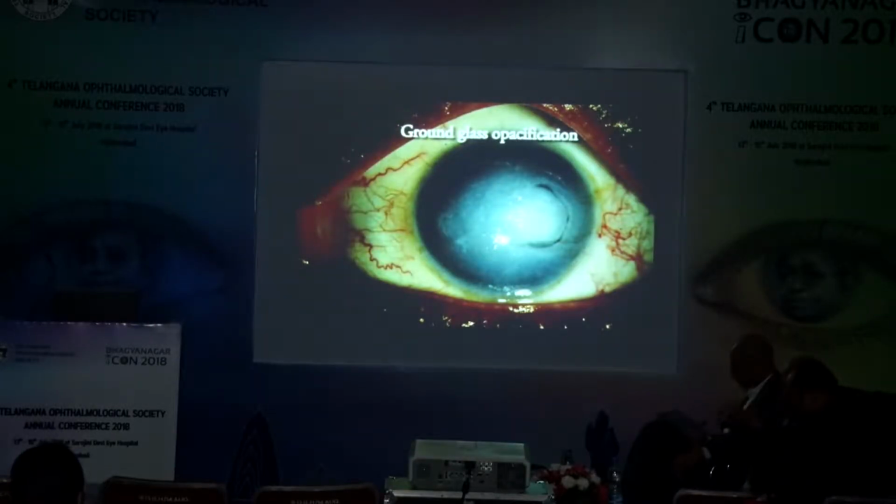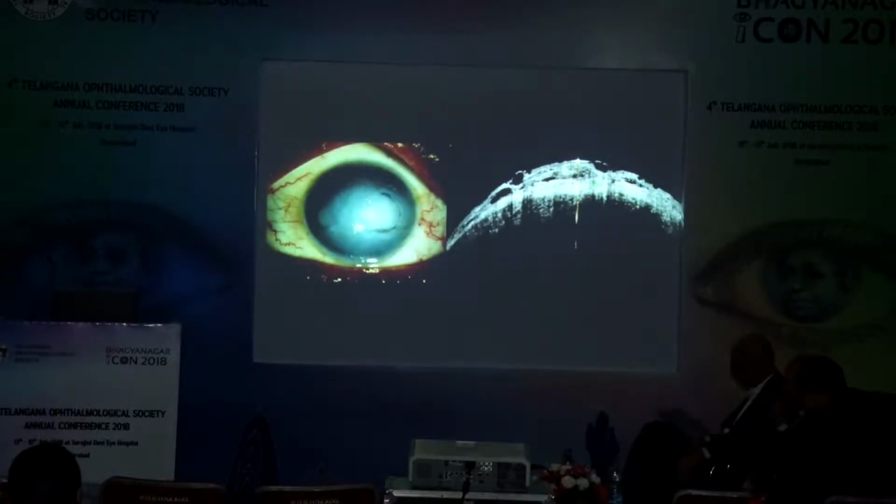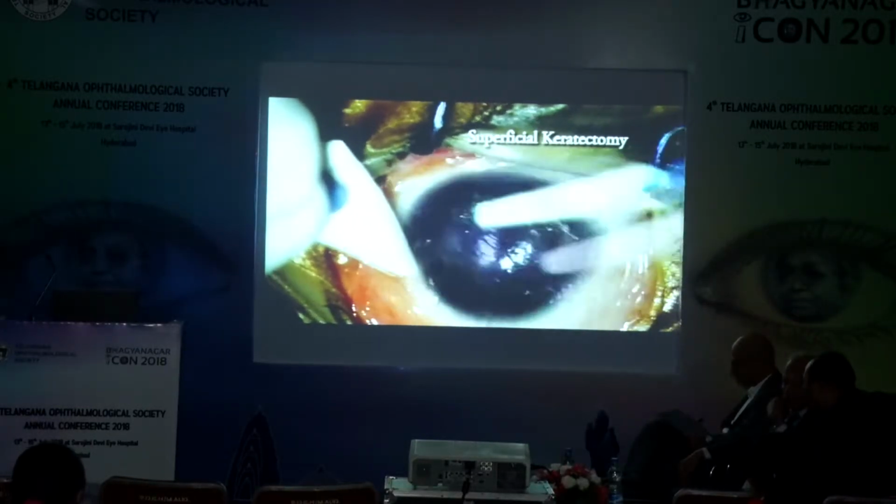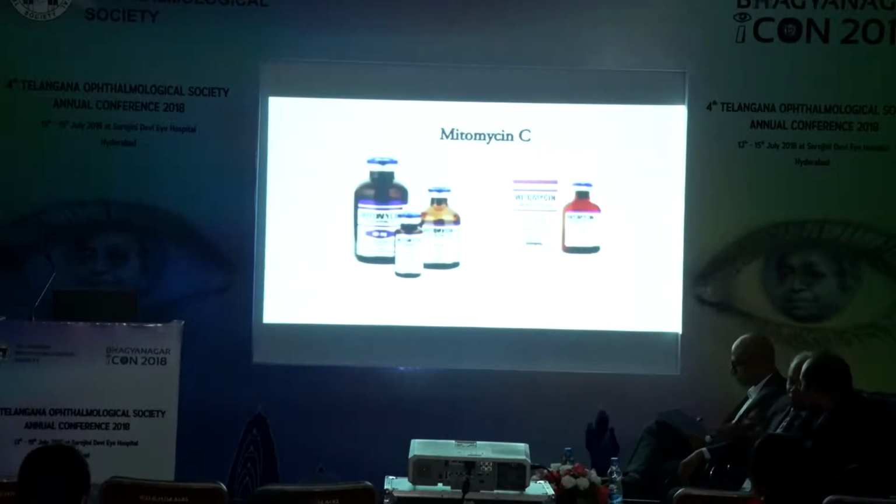In a subset of our patients with severe ground glass corneal opacification due to late presentation, DSEK was attempted in conjunction with superficial keratectomy and mitomycin C application, which resulted in significant resolution of corneal haze.